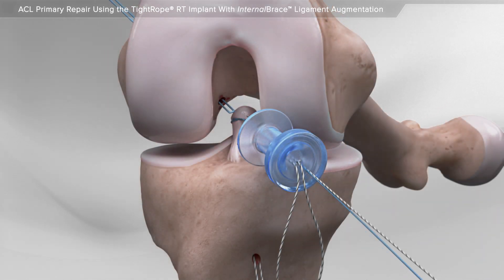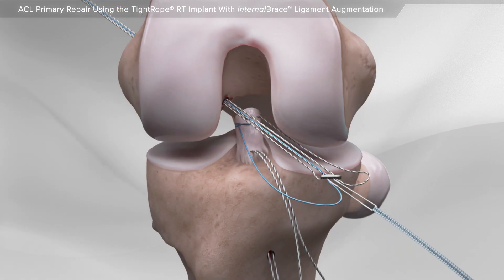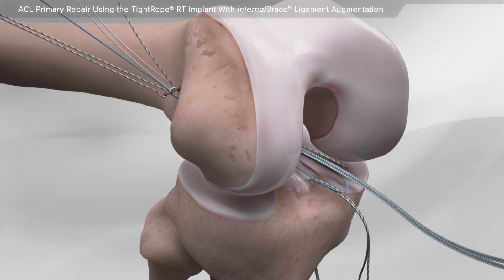Next, the repair sutures are passed through a special implant. Together, they are passed through the tear site and tightened to reattach the ligament to the bone.